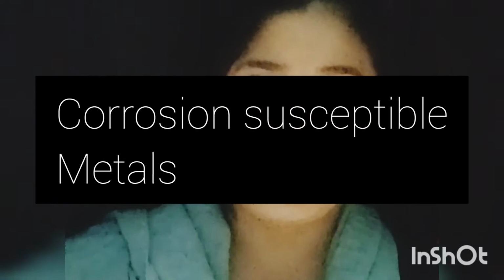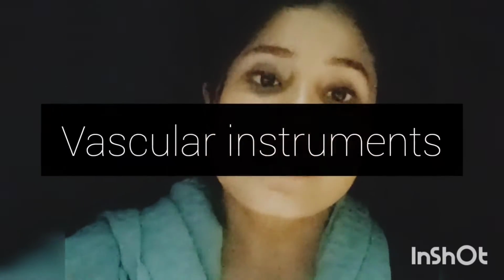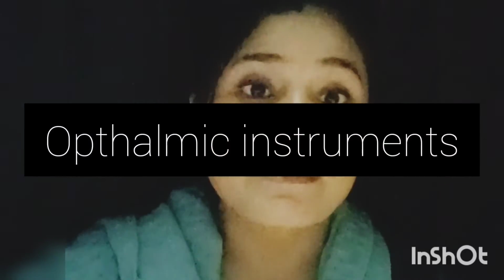Also electrical devices, corrosion susceptible metals, vascular instruments or spine sets, and all instruments that cannot withstand high temperatures, like ophthalmic surgery instruments. So mainly ophthalmic instruments are sterilized by gas plasma sterilization.